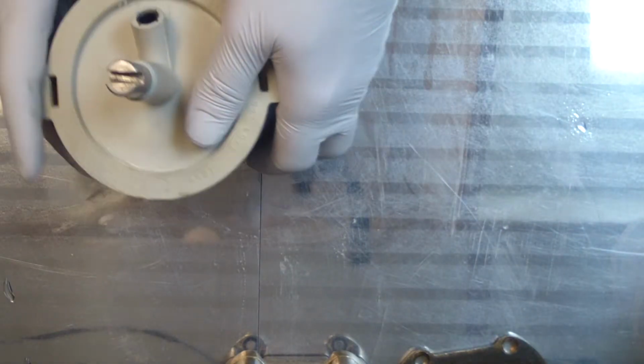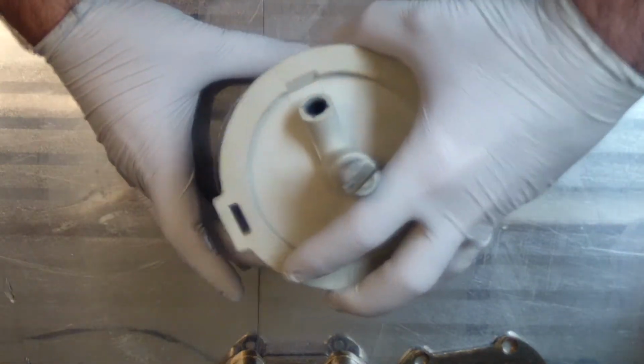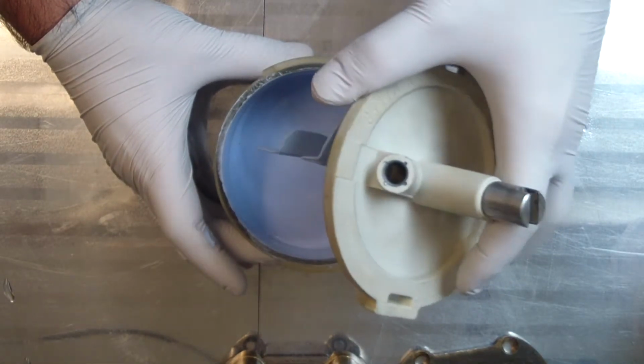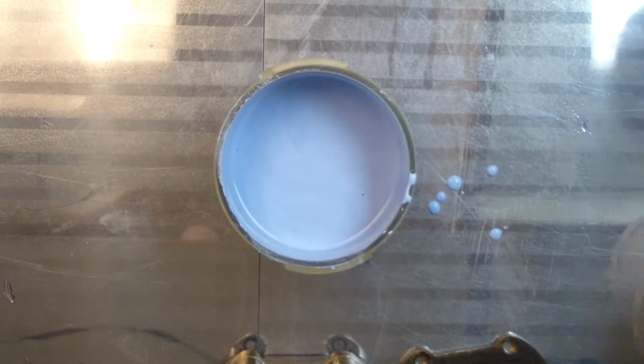So I generally will vacuum mix the stone for about 30 seconds, 30 to 40 seconds. I don't really place a timer on it or anything else like that. I just do it until it feels kind of right to me, personally. So that's probably just about right to me. So at this point you just open everything up and your stone is going to be pretty fluid at this point. So you just take your spatula and place it right in the sink.